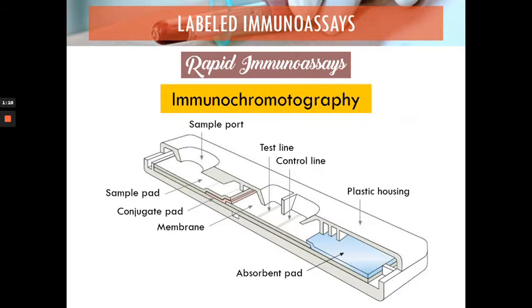But anyway, welcome to this further elaboration of your immunochromatography, because I remember during our pre-recorded lecture, the one that I uploaded on YouTube, I mentioned that I will include an example of immunochromatography so that you will really understand how it is done. I mentioned pregnancy testing, because it's one of the most popular kits used by people.